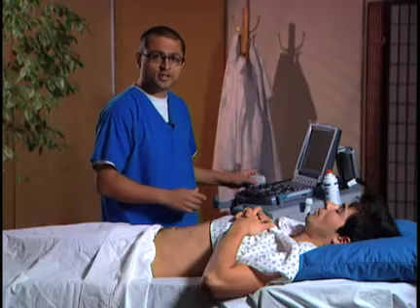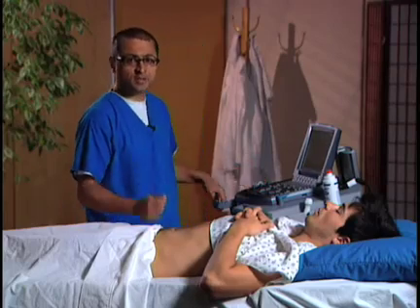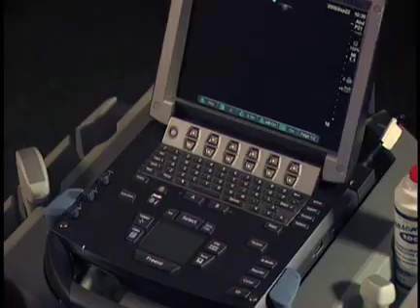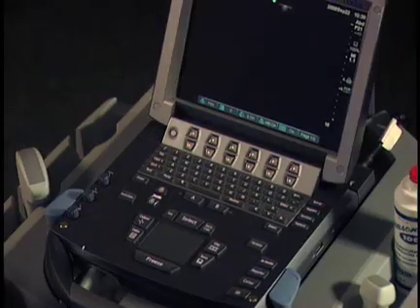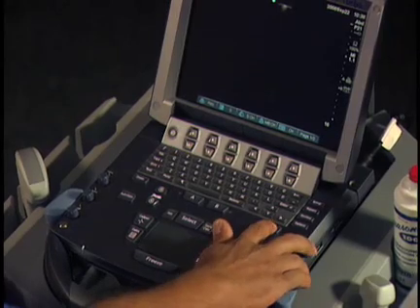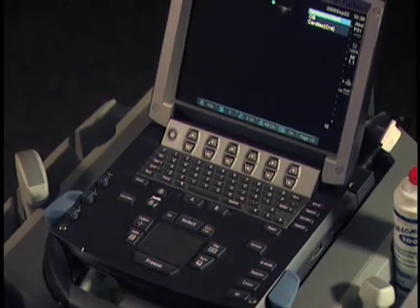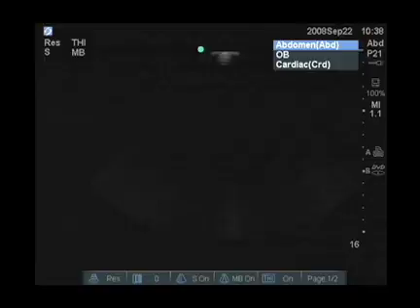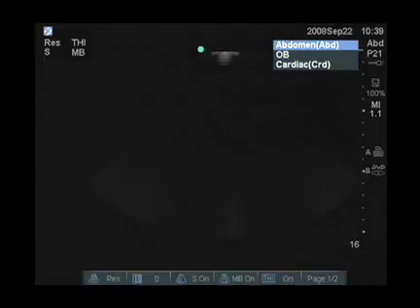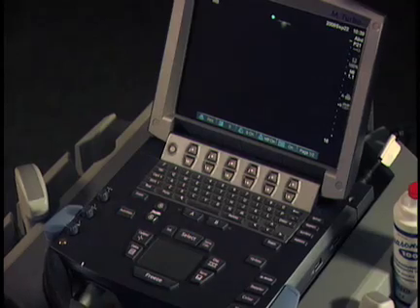Once you've chosen the transducer, the next step is to choose the exam type on the machine. To choose the examination configuration, we hit the exam key right here. With the selected transducer, we can choose between abdominal, OB, or cardiac. For this exam, we're going to choose abdominal, so I'm going to hit select and we're going to be ready to start scanning.